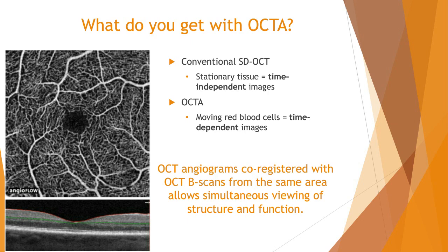The way I like to tell my students to think of it is to think about a waterfall. If I were standing in front of a waterfall and I took successive images of that waterfall, each successive image is going to look different because there's water, there's something flowing, something different between the images. So really, when you're looking at the angiogram alongside the B-scan together, you're going to get the ultimate visualization that you can, structure along with function.